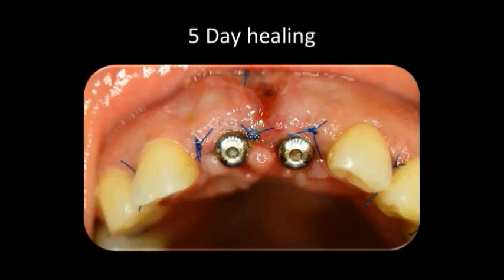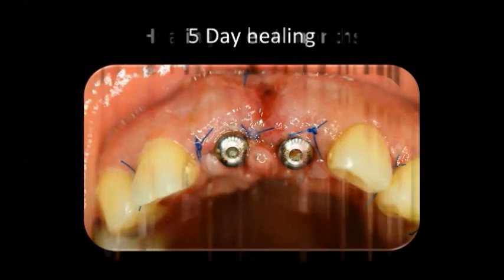We can see already that we're correcting the bulge on the buccal side, and that defect is nearly disappearing. And as I said to you at the beginning, I augmented in the area of the roots in order to mimic the nature of the ridge, to have the same kind of appearance as the adjacent teeth.